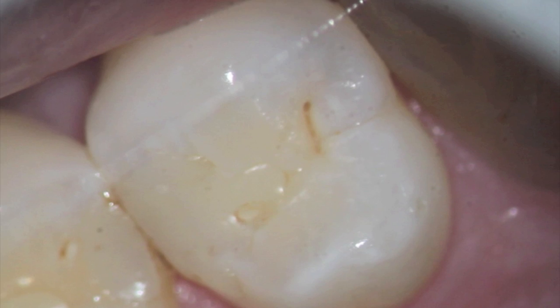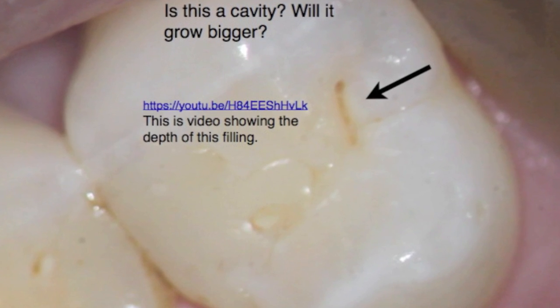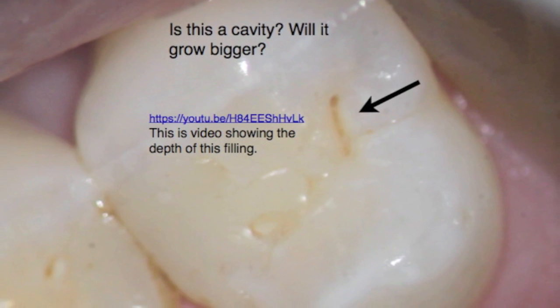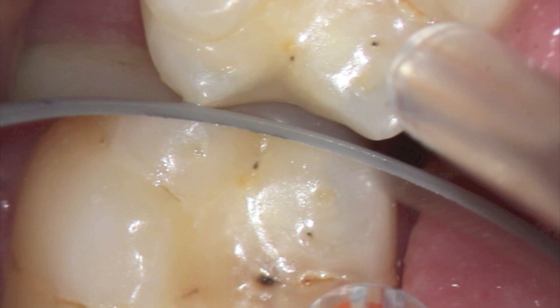Here's the incipient decay, and as I had mentioned, it looks just kind of like a normal area, but in this case we were able to diagnose it with the laser and it told us that it was decay. You can go to that YouTube video and see that.